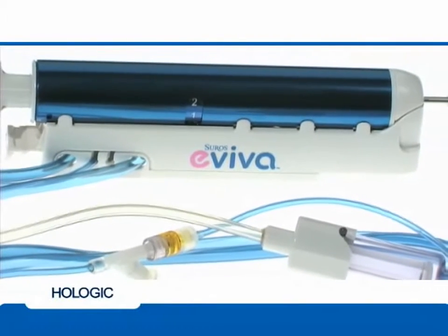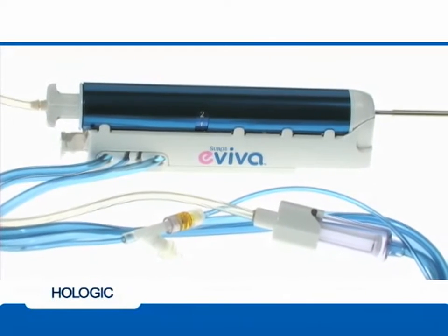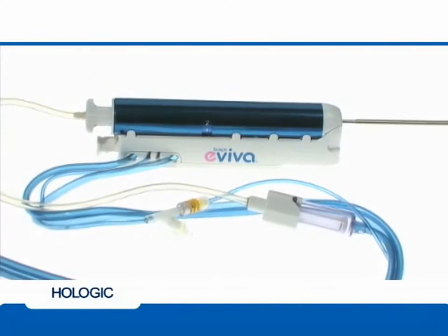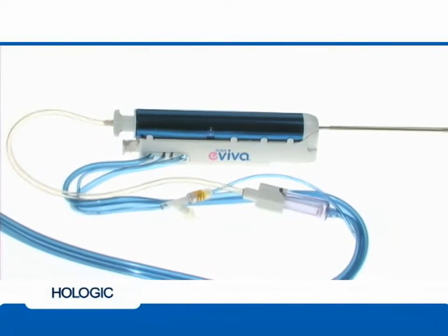The Eviva breast biopsy device is designed for fast and easy use. Because the console can be set up and tested in as little as one minute, the lesion in question can be confirmed with imaging before the disposable device is opened for use.